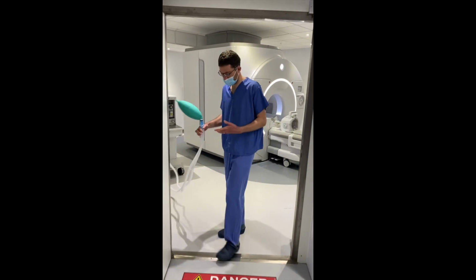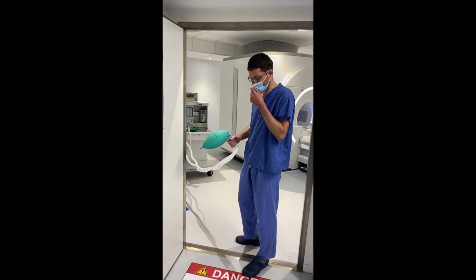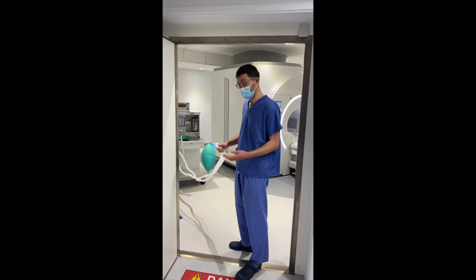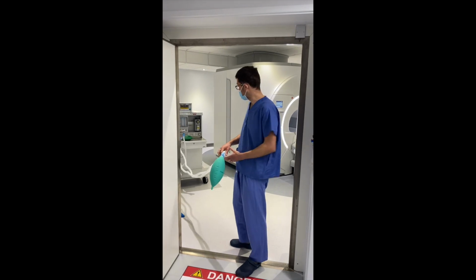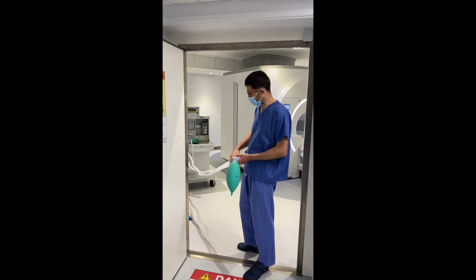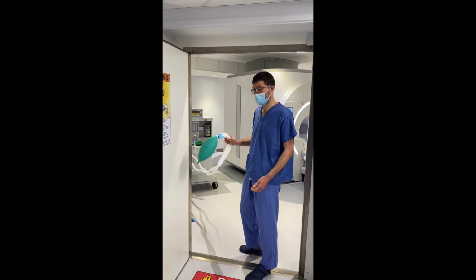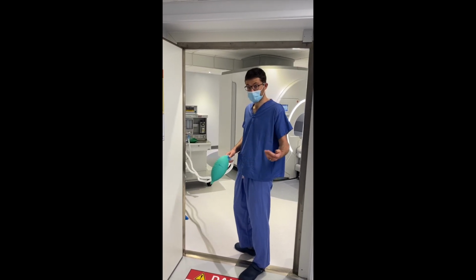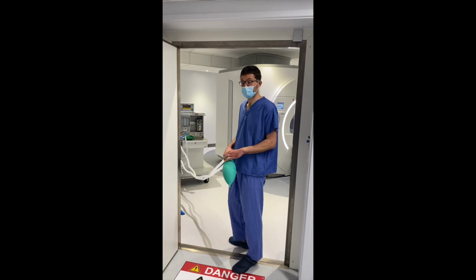And then when you're taking the patient out of the MRI scanner to transfer them back onto the transport vent, you do the opposite. So bring them out on this anaesthetic machine on the long circuit. So you'd have a longer circuit than this. This is a standard circuit, and then clamp the tube, turn the vent off, and transfer them over to the other ventilator.